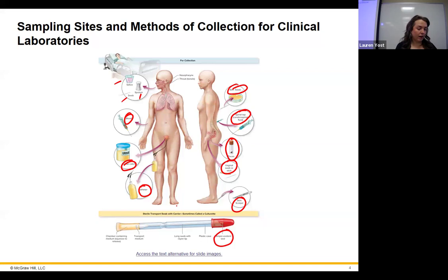We have a plastic case. It's usually a soft plastic case, and there's a reason for that. I don't mean super soft, but soft enough you can squeeze it. It really looks exactly like a cotton swab in there, with transport medium at the bottom. Whenever you swab somebody's throat or something, you put it back into that plastic case.